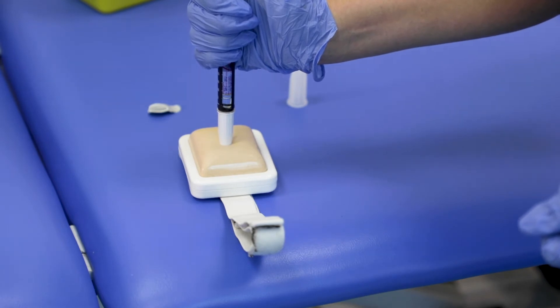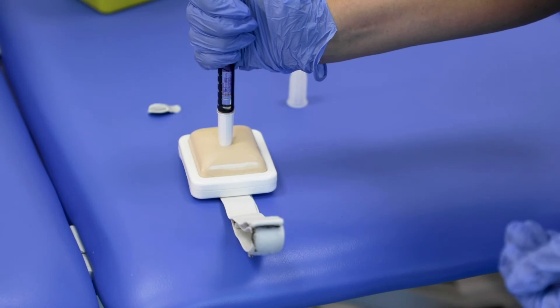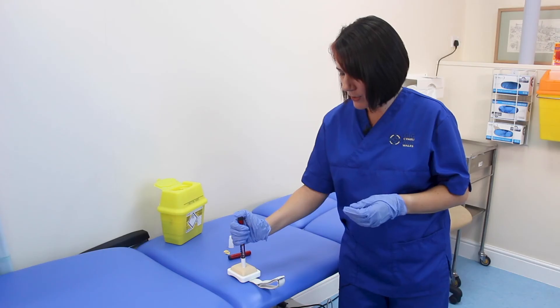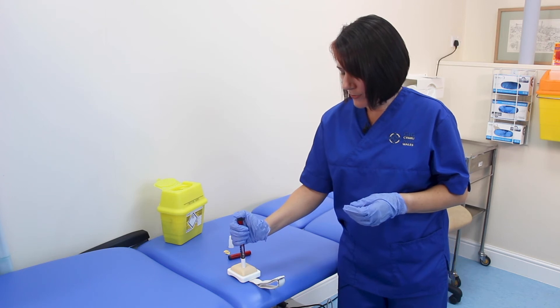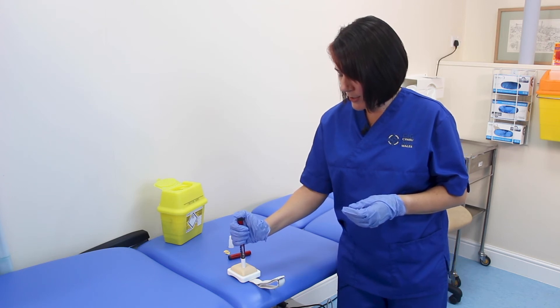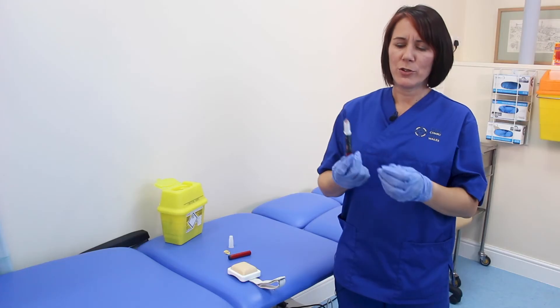Count to 10 seconds. Whilst you're counting to 10, make sure you maintain constant pressure on the plunger — one, two, three, four, five, six, seven, eight, nine, ten.